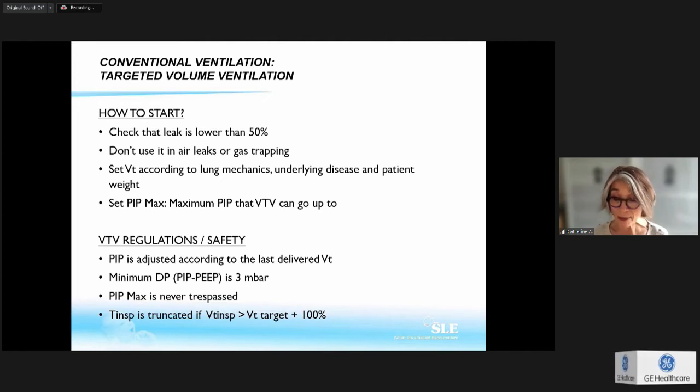Look at my patient. Is it because my patient has some spontaneous breath? Yes, the patient has some spontaneous breath. Does it mean that I can extubate my patient? The respiratory drive of my patient is fine. Maybe the pressure is quite low now. I don't have any fever. I don't have secretions. Every parameter is okay for weaning. Maybe I can extubate my patient. What is happening is that my patient, when he takes a spontaneous breath, has already exceeded the tidal volume that I have set. So that is the first question that I will ask myself.